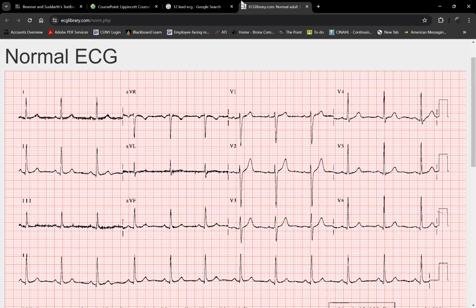However, doctors, especially if it's an abnormal rhythm, the lead where the abnormal rhythm occurs tells the doctor where exactly the problem is. So let's say it's a heart attack. This will give the doctor an idea about where exactly, which artery he thinks is blocked, which is causing the patient's abnormal rhythm. Does that make sense? Okay.